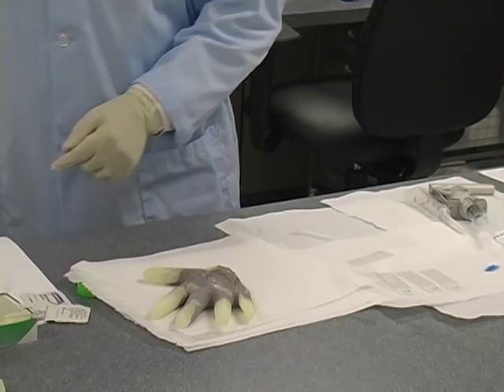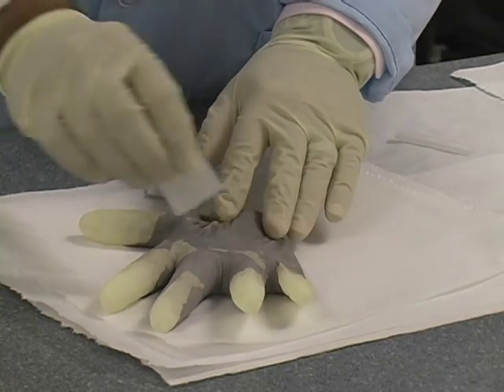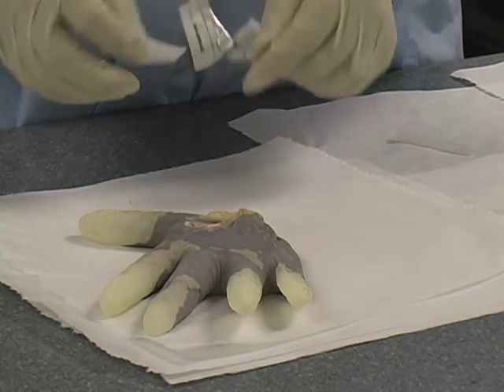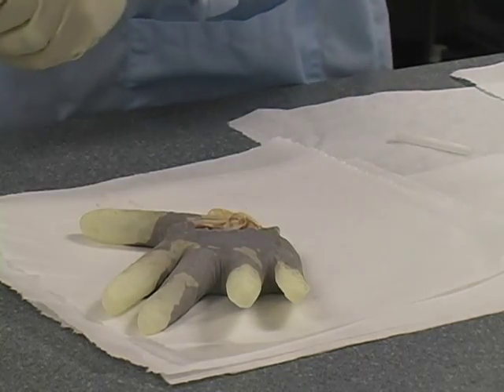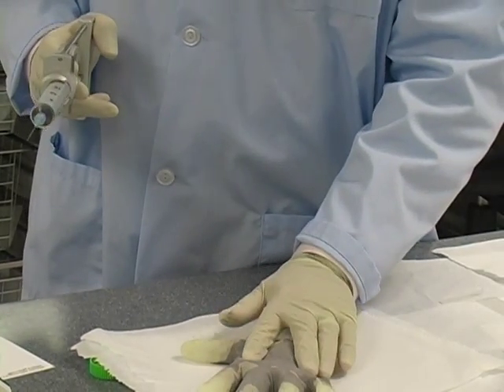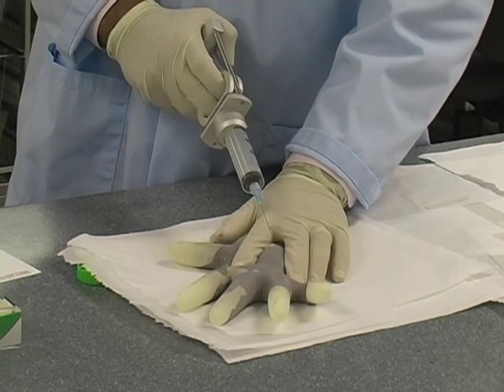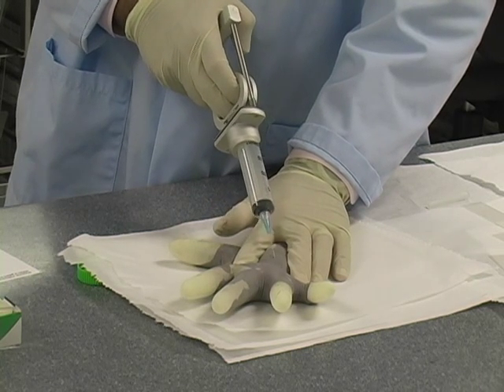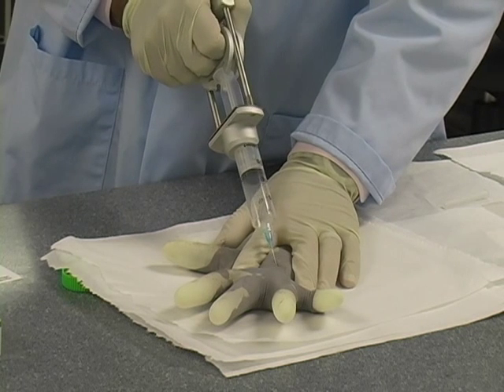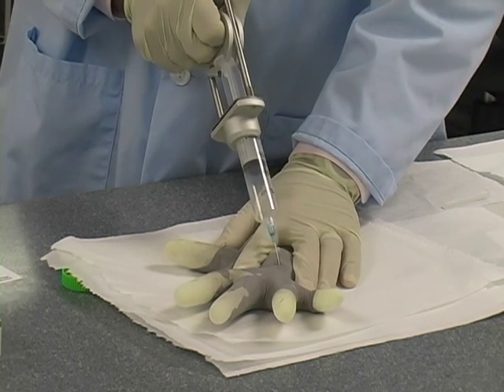I do this every time before I go into the skin to avoid getting problems with infection. After cleaning the skin, what I do before I go in is always fix the lesion between my fingers — that's key. With the Kimiko gun, some people take a sort of pistol-grip approach; you can do that if it feels comfortable. Just go into the lesion, vigorously moving the needle back and forth — that's key. In the process I apply suction continuously while going in and out until I get the number of passes I want.